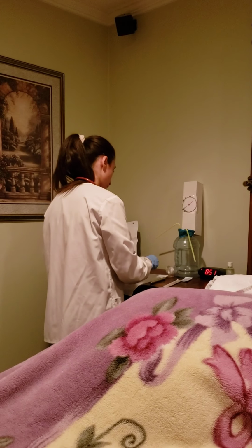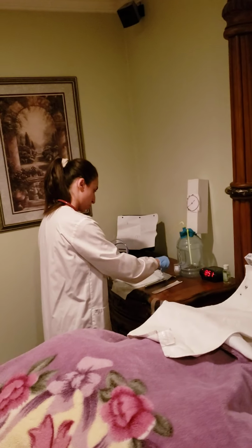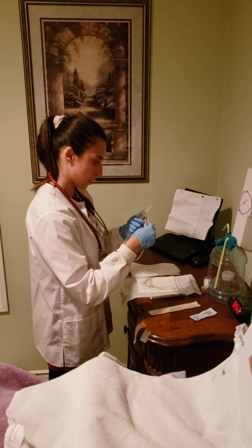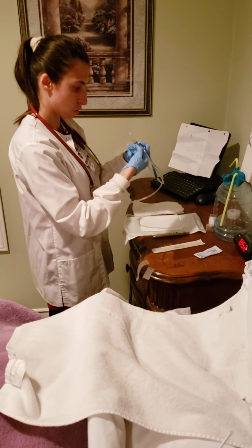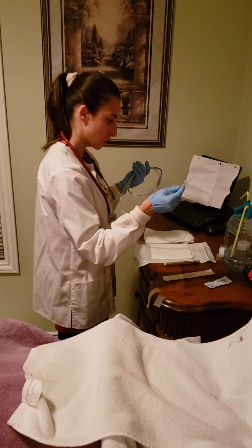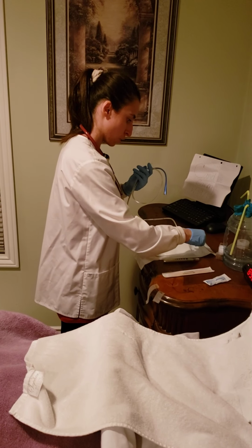Okay, now I am going to take some lubricant, put it here, and I am going to curl the edge of the tube to my index finger as it goes. It's kind of curved, and I'm going to coat it with 3 to 4 inches of lubricant.